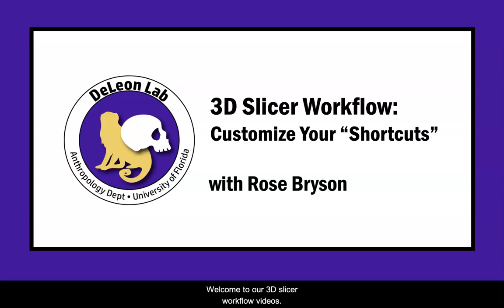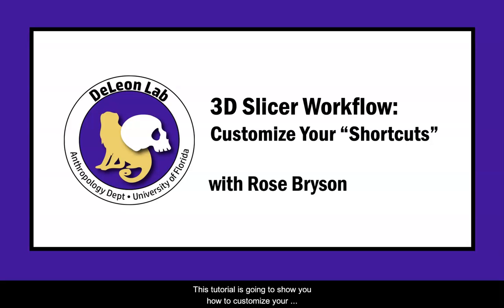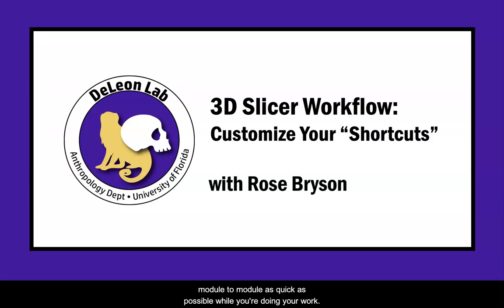Hello and welcome to our 3D Slicer workflow videos. This tutorial is going to show you how to customize your module shortcuts so that you can move smoothly from module to module as quick as possible while you're doing your work.